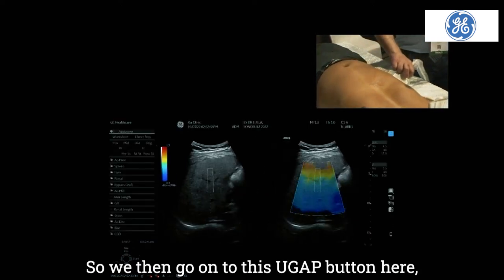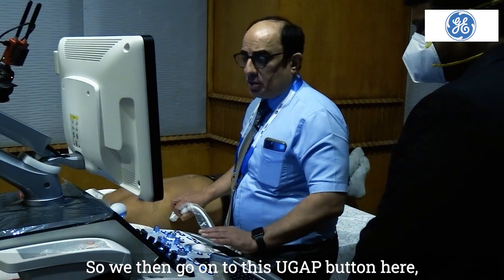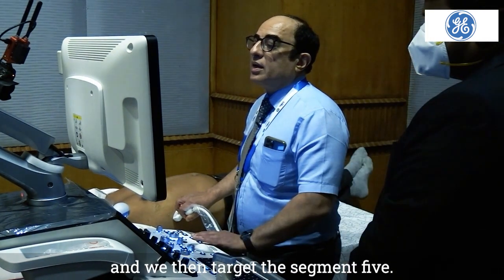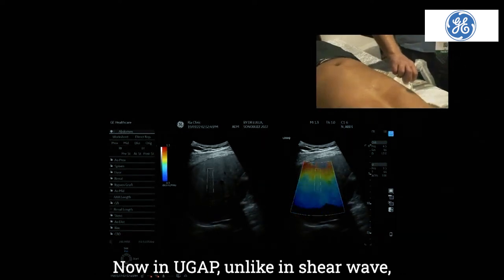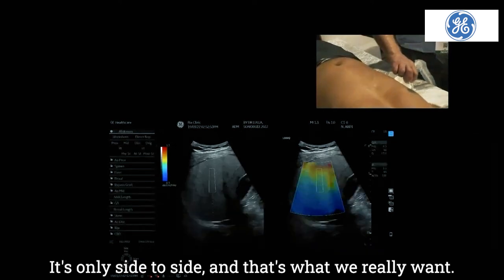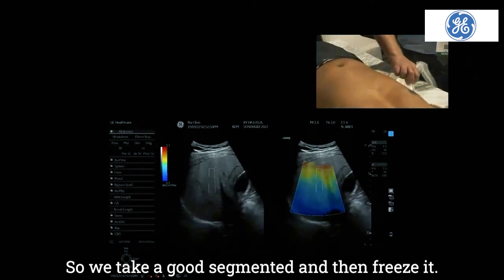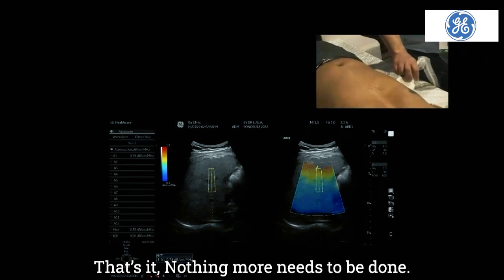So we then go on to this UGAP button here, and we then target the segment 5, and you can see this myriad of colors here. Now in UGAP, unlike in shear wave, you can't move the ROI from up to down. It's only side to side, and that's what we really want. So we take a good segment, breath hold, and then freeze it. That's it. Nothing more needs to be done.